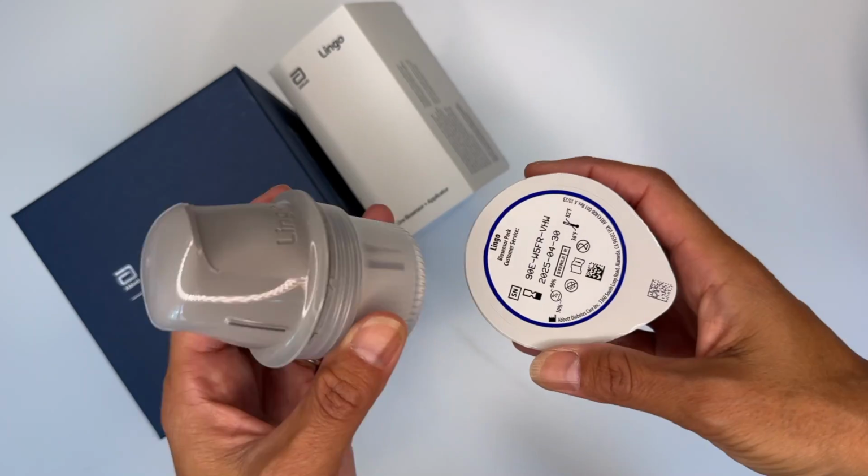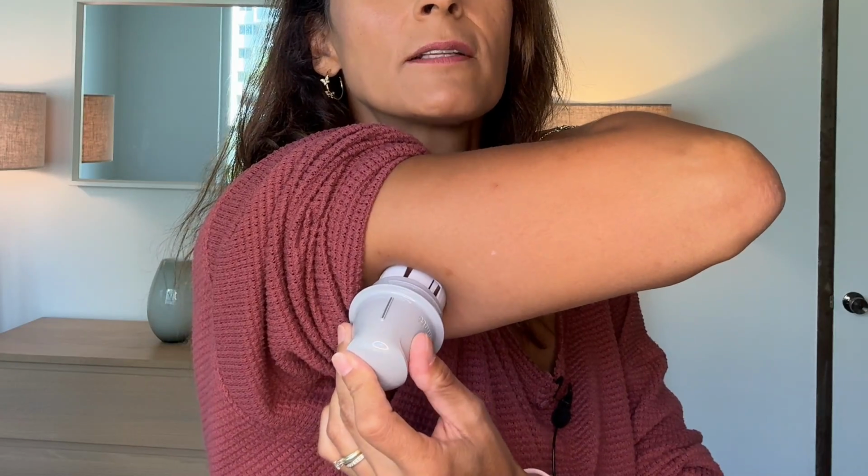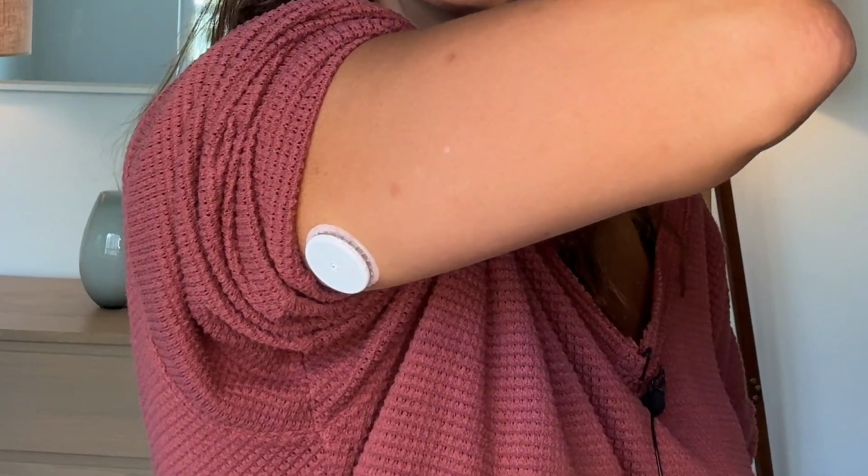But there are also other options available, including the over-the-counter Freestyle Lingo Biosensor. I tried the Freestyle Lingo as well, and I think a choice between Lingo and Stelo, well, at least to me, isn't exactly clear-cut. Freestyle Lingo is not intended for people living with diabetes, and it's based on the Freestyle Libre 2 technology, so that's a big sensor.